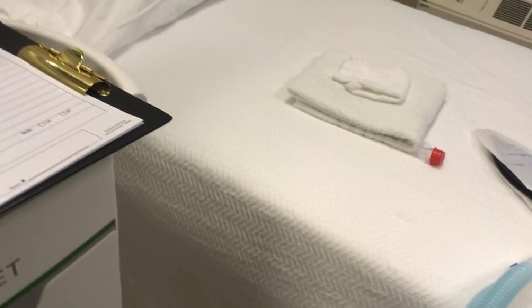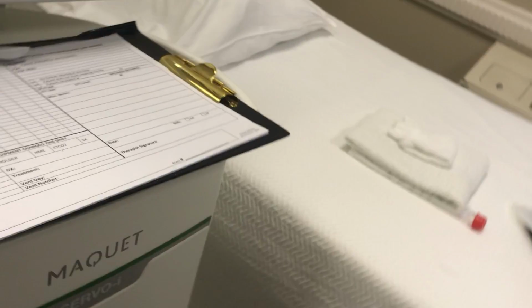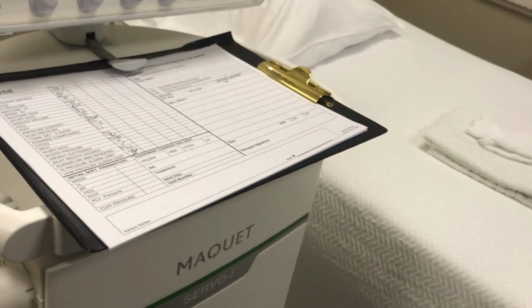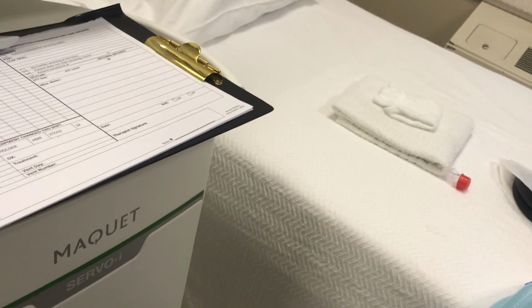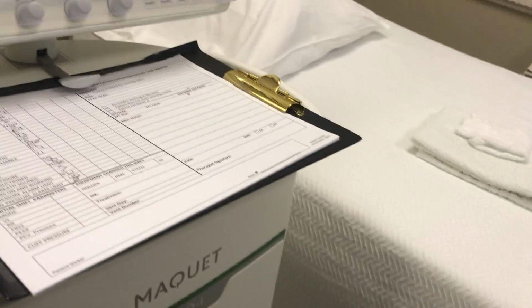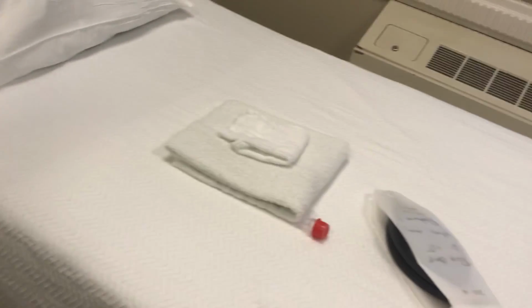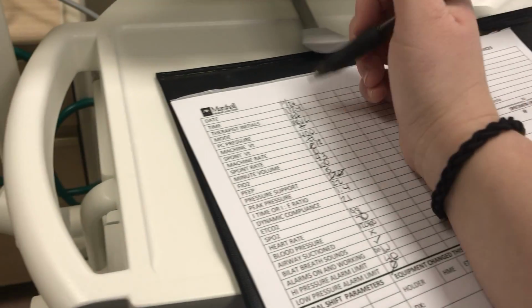Okay, I'm going to walk through a vent check. I would walk in the room, introduce myself to the patient and family that may be in the room. Then I would assess my patient's vitals, breath sounds, and if they're not meeting some settings, then I would try to find out the reason from the assessment. Then I'm going to go over and check my vent, which is done every 2 hours.